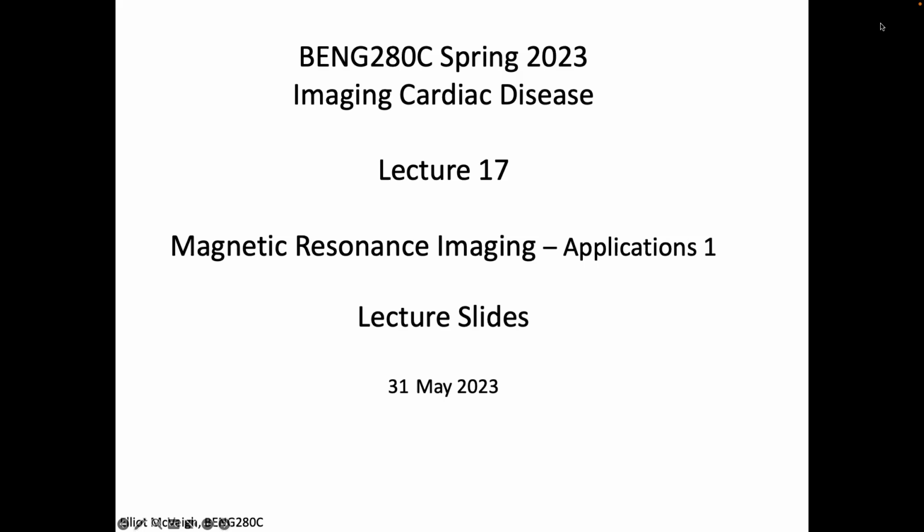The heart you measure when the QRS occurs in that 750 millisecond R to R interval is slightly bigger than the one you image in the 1,000 millisecond interval, because the shorter 750 milliseconds means it fills less, so the heart is geometrically a little smaller. If you have an alternating artifact like that, you take data at the 750 and then at the 1,000, and those two data sets are interdigitated however you're interdigitating your k-space data.